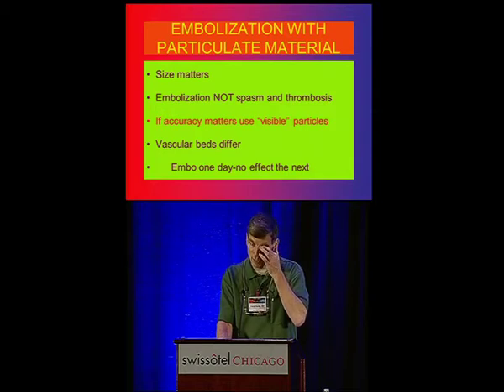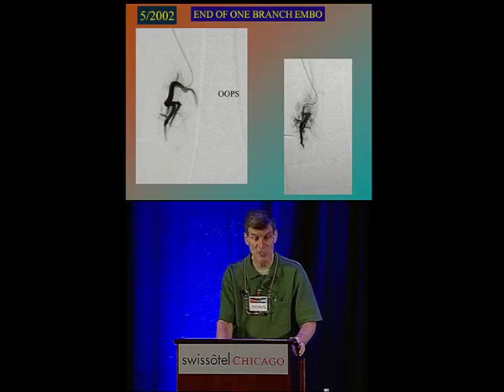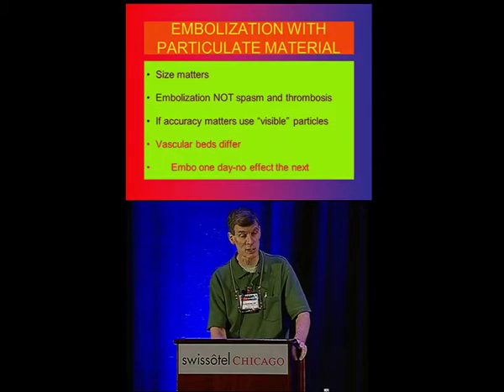And you always try and make your particles visible somehow to make sure you can see them. The best way is with contrast, so that if you're injecting particles and you're coming towards the end, you can slow down and make sure that you don't get any more reflux.